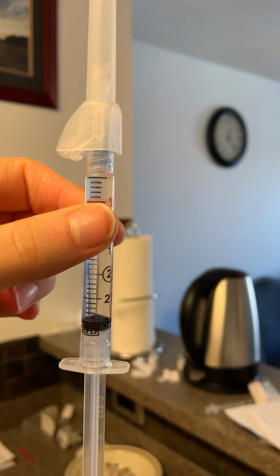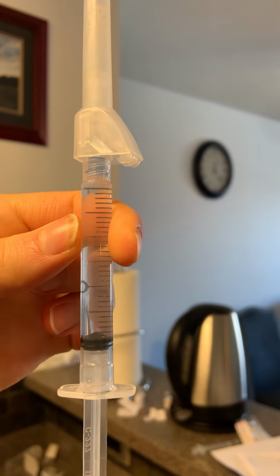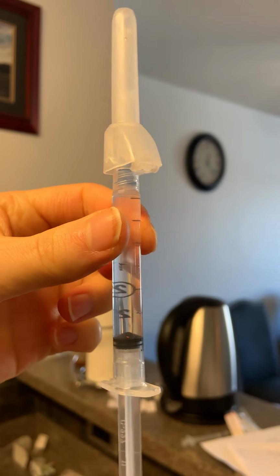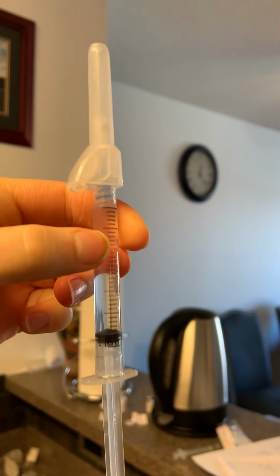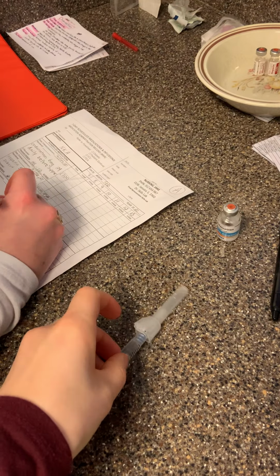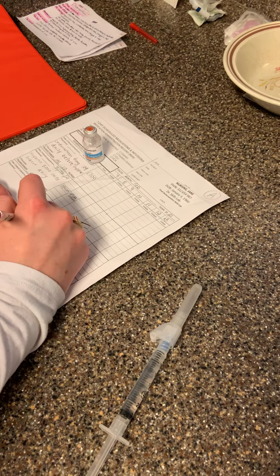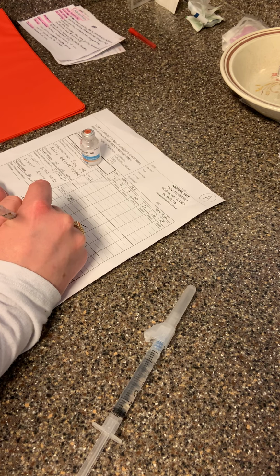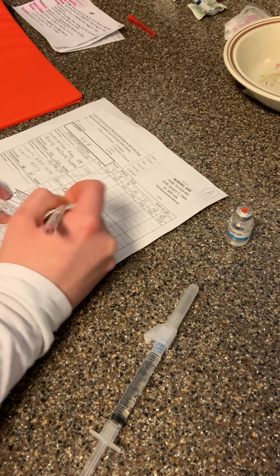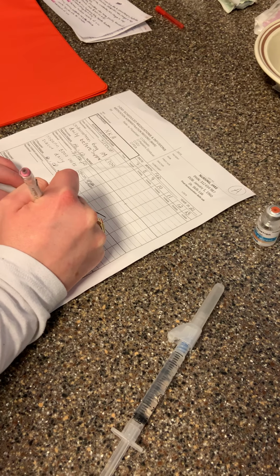And while you're checking that, I am just going to make a label. So I have Jake Nursing, ondansetron, IM, 6 milligrams. The volume is 3 milliliters because the concentration on the vial is 2 milligrams per milliliter. It is February 7th, 2021 at 16:35, and my initials is CMUMSN2.